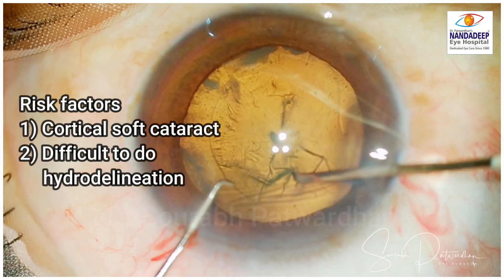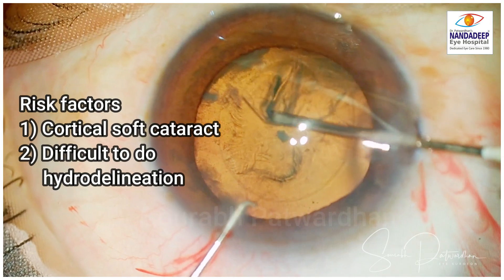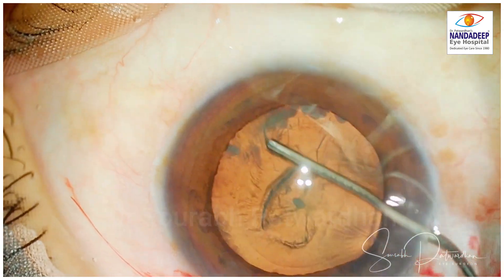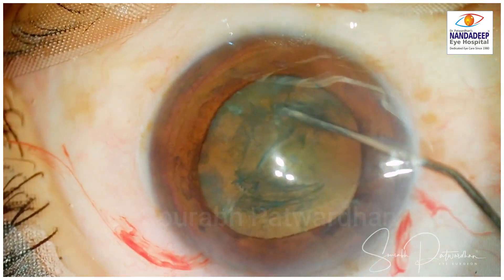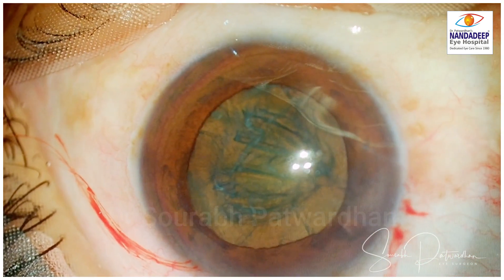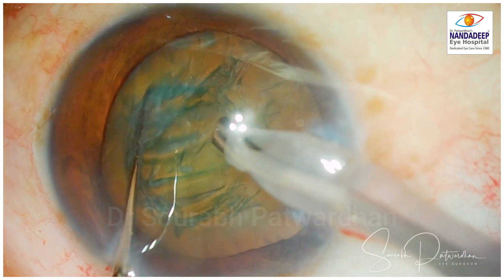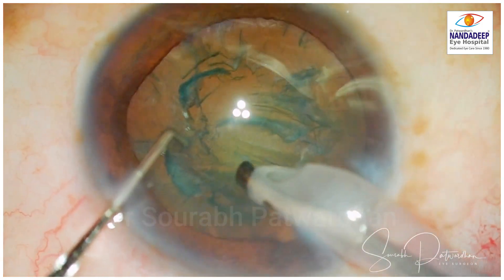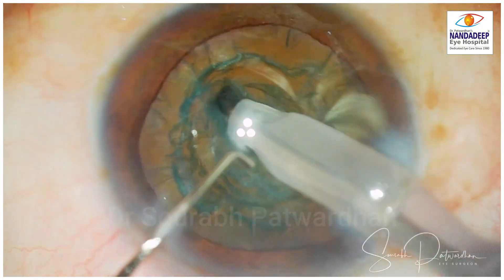It is a cortical cataract and soft cataract where it is difficult to do hydro delineation. If you find these kind of cases, you should be aware that you might face issue of this bowl formation. The nucleus is too soft and as you can see here, it is difficult to do hydro delineation because the cortical area is a little bit more sclerosed or more dense compared to the central part. You don't get those hydro delineation rings and many of these cortical elements kind of hold the nucleus back, with some adhesion or stickiness there.